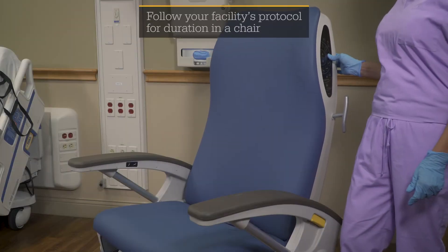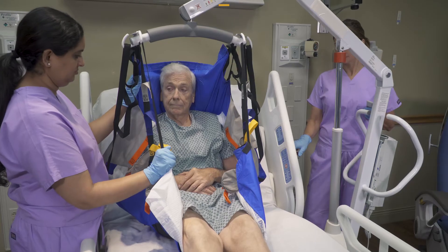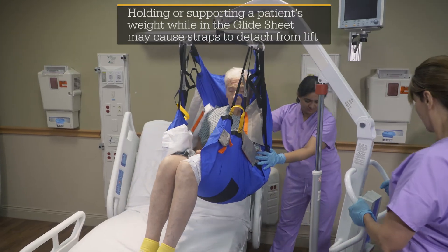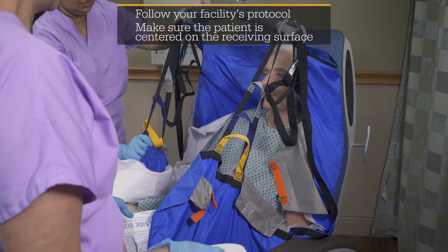If transferring to a chair, slightly recline the chair, lock the brakes, and raise the footrest. Use the lift to raise the patient above the support surface. Transfer the patient to the receiving surface and lower the patient until the sling straps are no longer in tension.